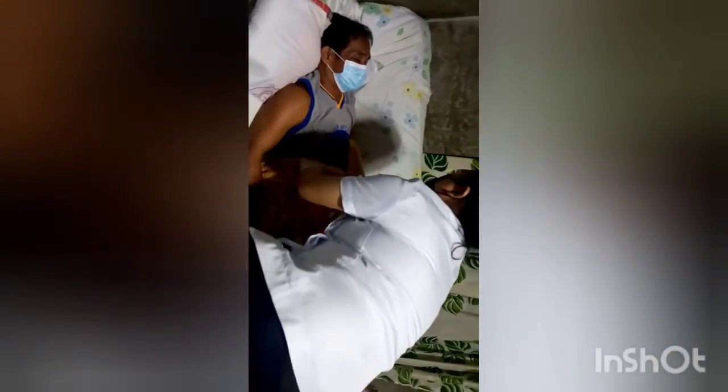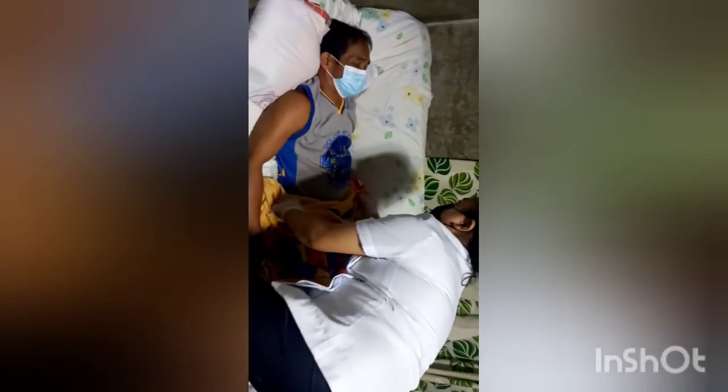Expose the legs and the arms. So, we just need to expose the area which is needed to be utilized.